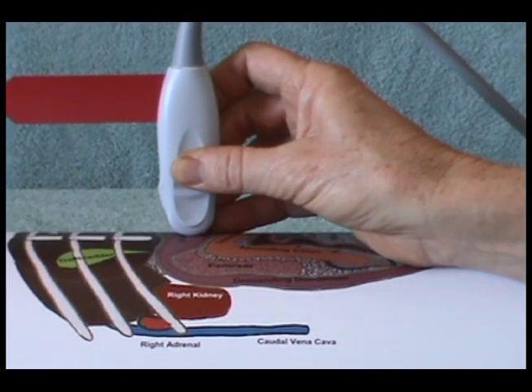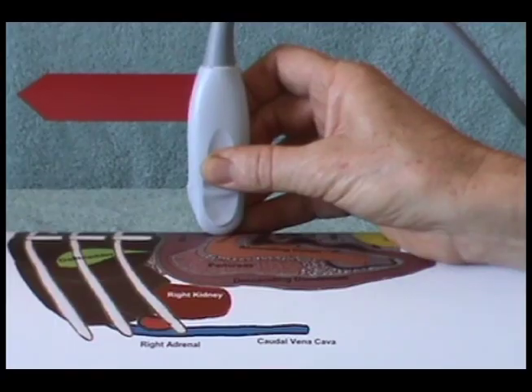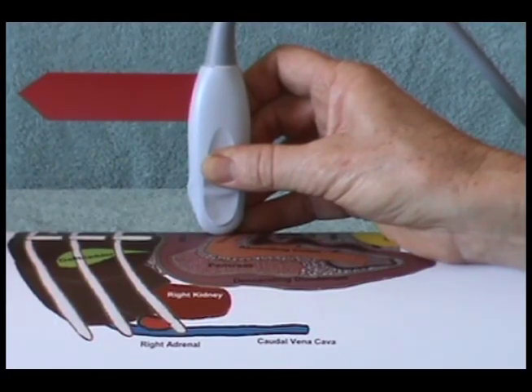After the wall measurement, slide the transducer caudally to center the caudal wall of the stomach under the transducer. The ultrasound beam will usually overlap the caudal wall of the stomach and the transverse colon. The left limb of the pancreas is between the caudal wall of the stomach and the transverse colon, so it will also be on the ultrasound screen.